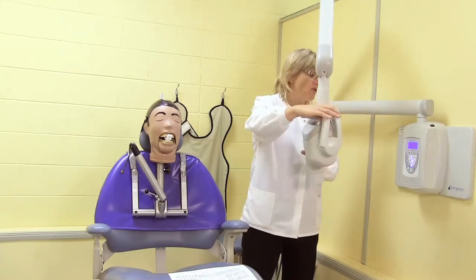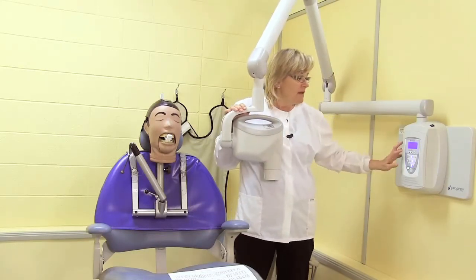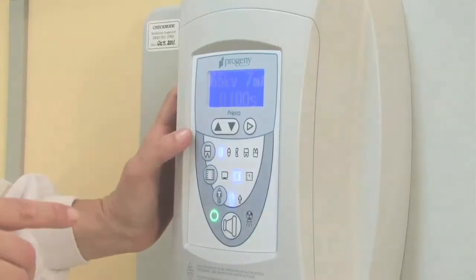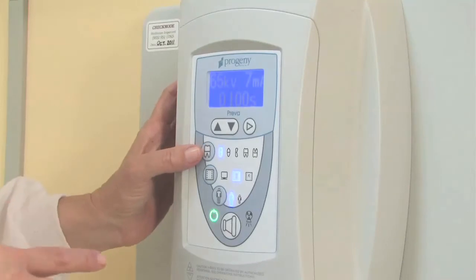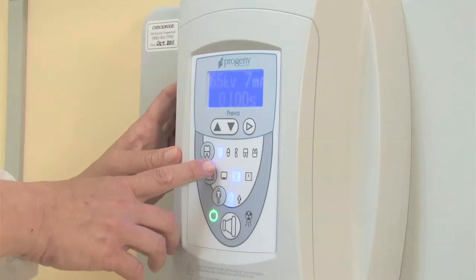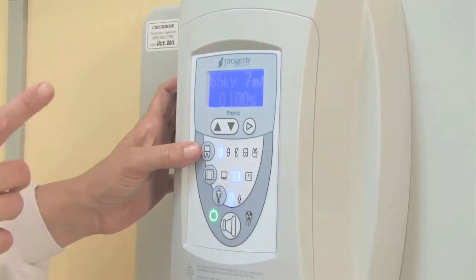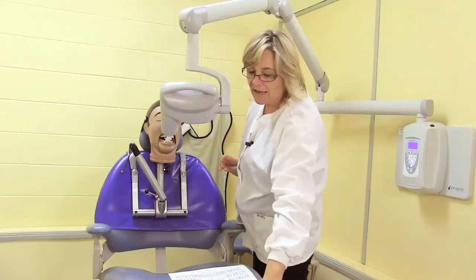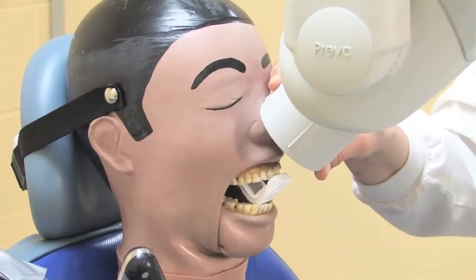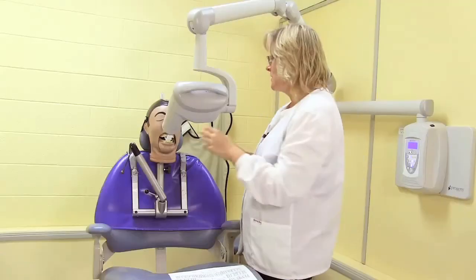Now, what I will do is I get my X-ray tube head with the PID ready, and I look at my X-ray machine to see what the exposure should be. In this case, I will place it on the incisor exposure, which is for both maxillary and mandibular incisors. By placement, again, what I like to do is think about my point of entry, again outlined on your sheet, and my point of entry is through the tip of the nose. The angulation, in most cases, should be plus 40 degrees.